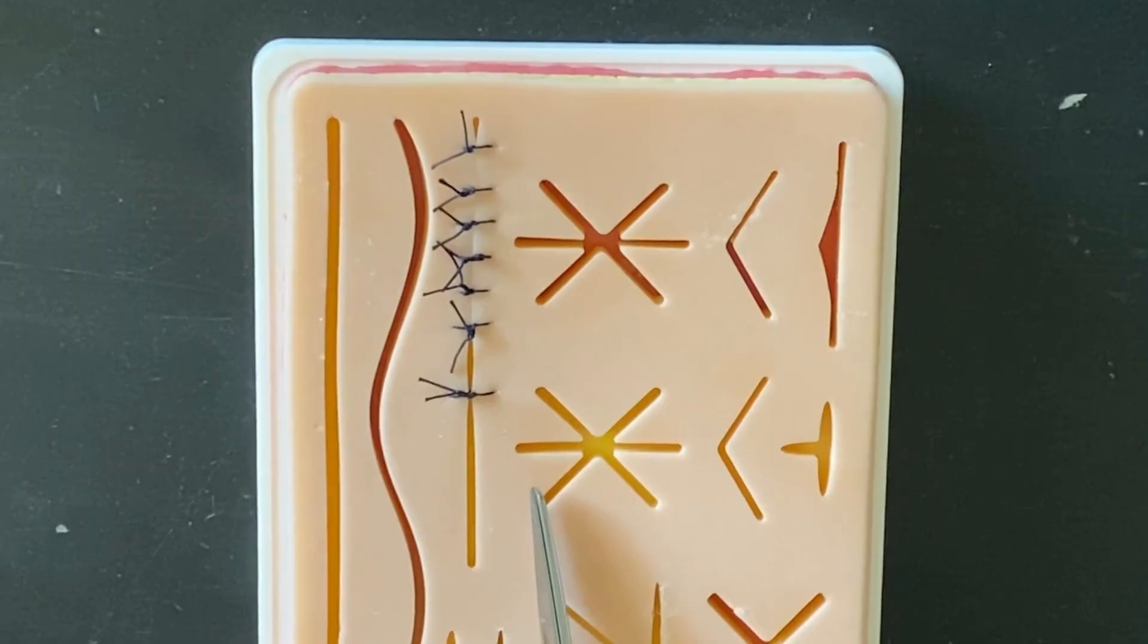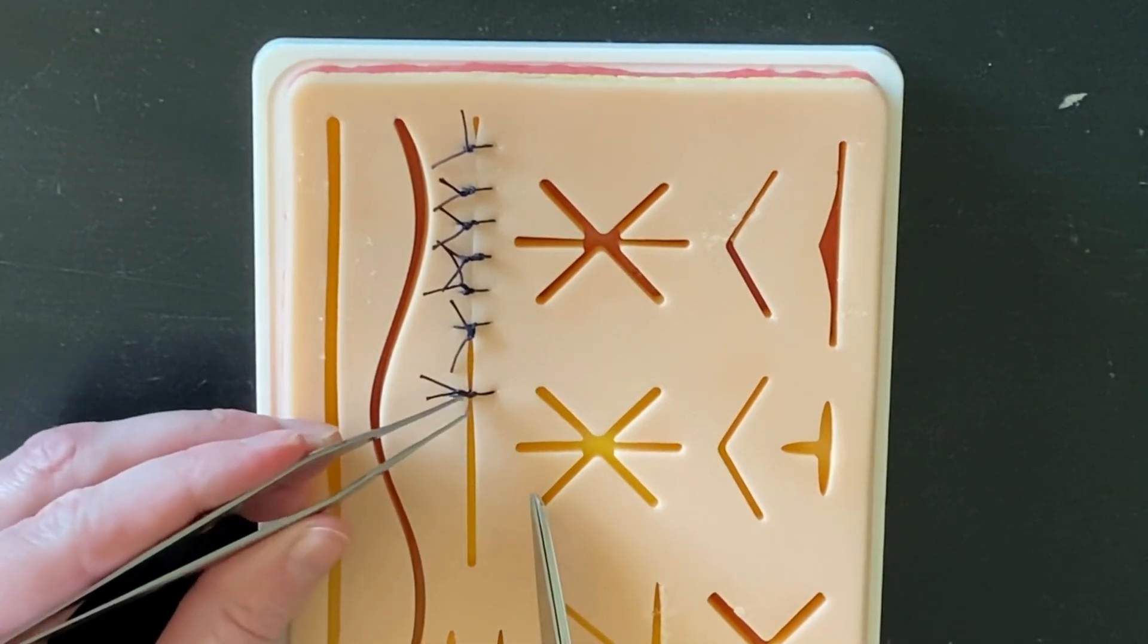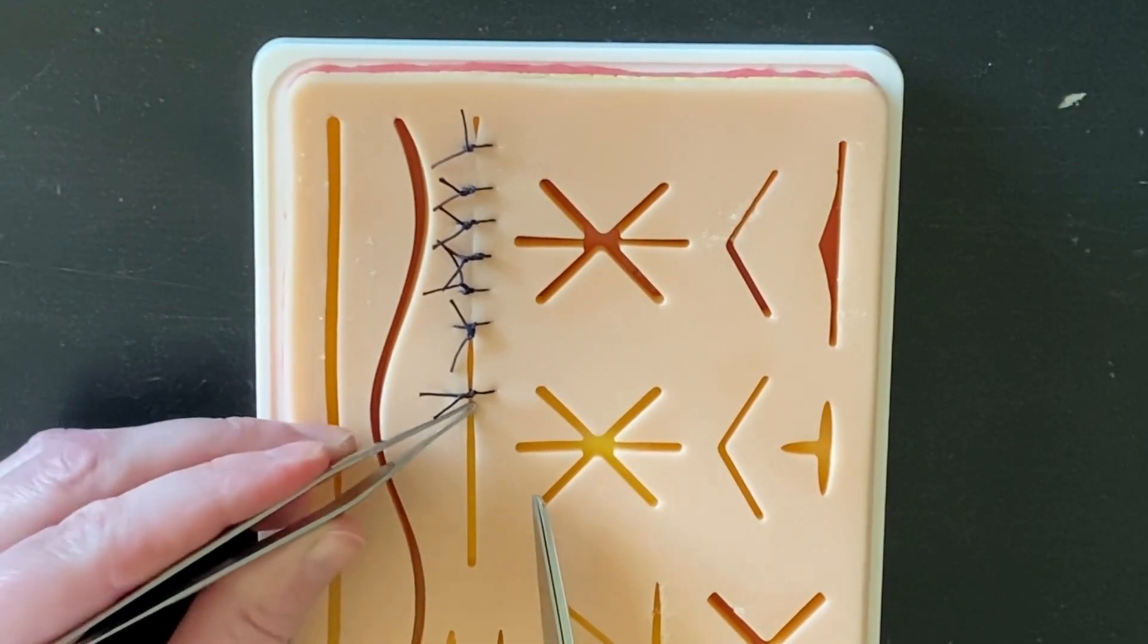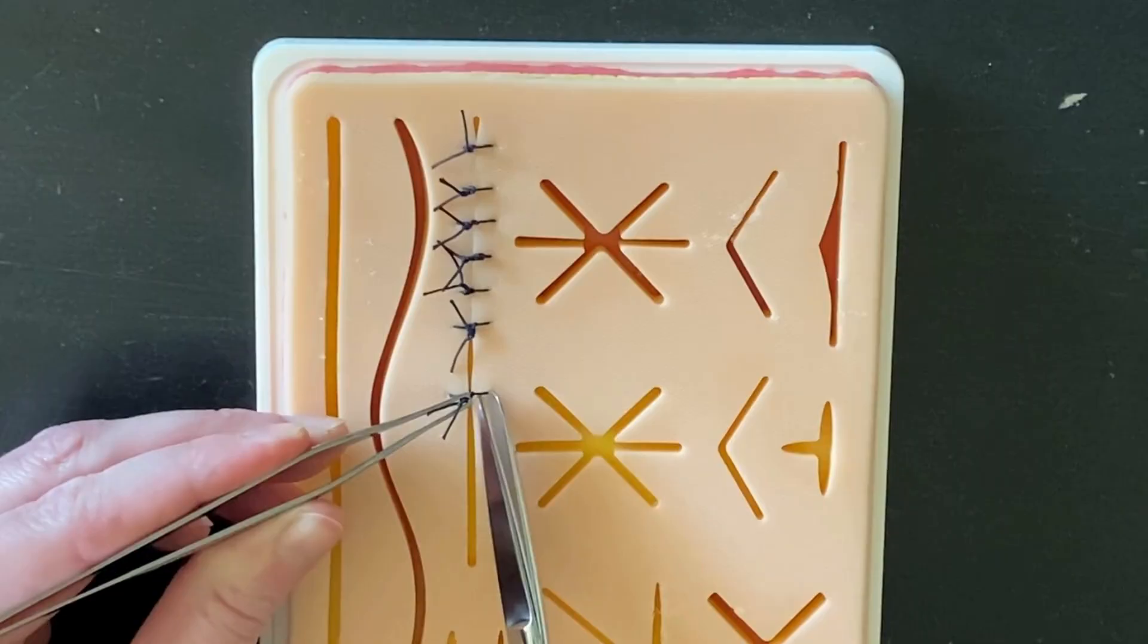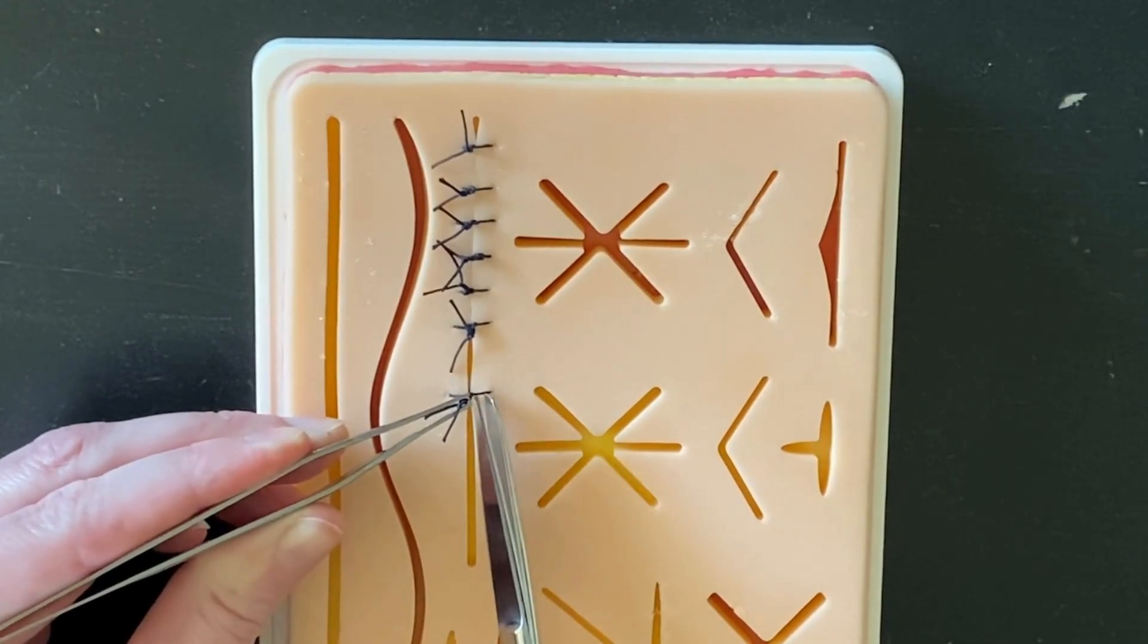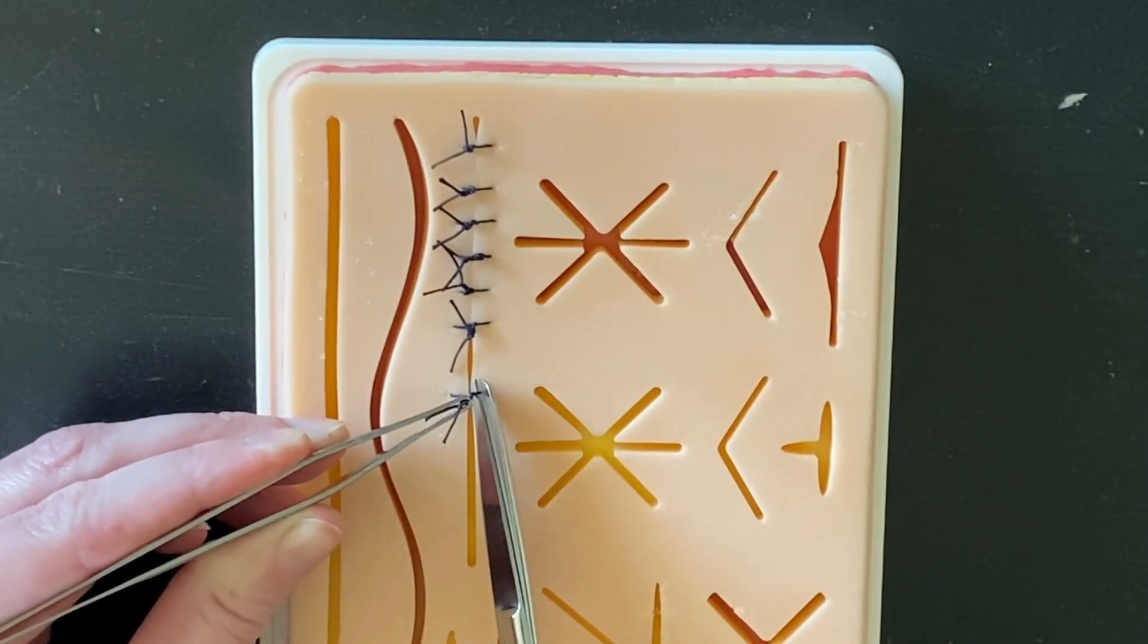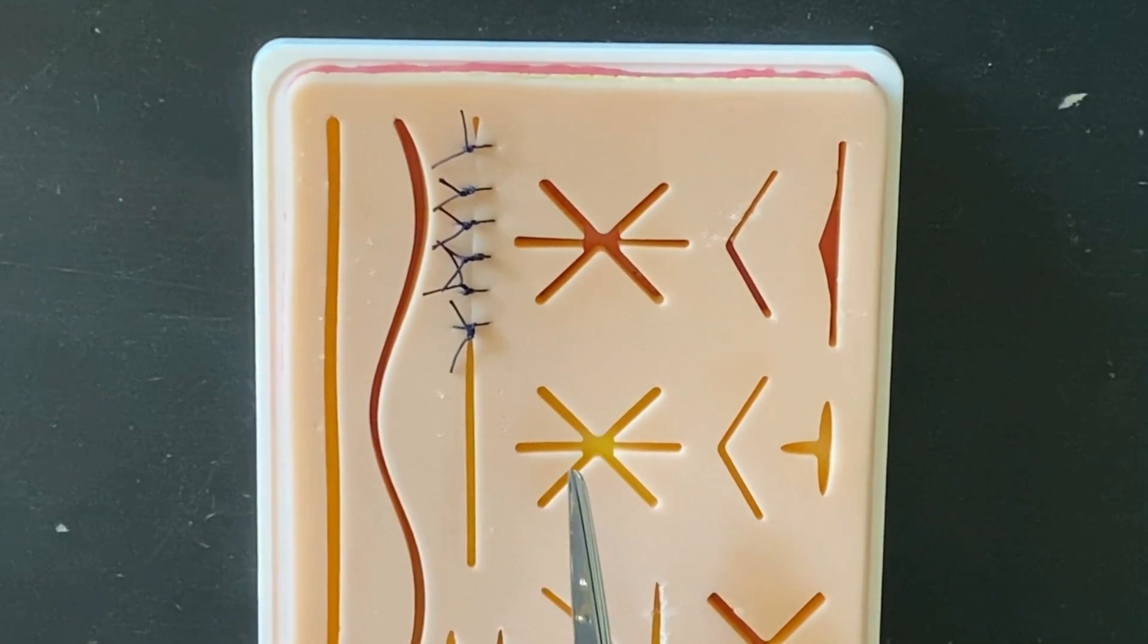When you pull it out, you're pulling the suture in one motion instead of having to search for part of the suture that's buried underneath the skin. And again, pulling the knot away from the skin, inserting the small tine of the suture scissors and cutting that way.